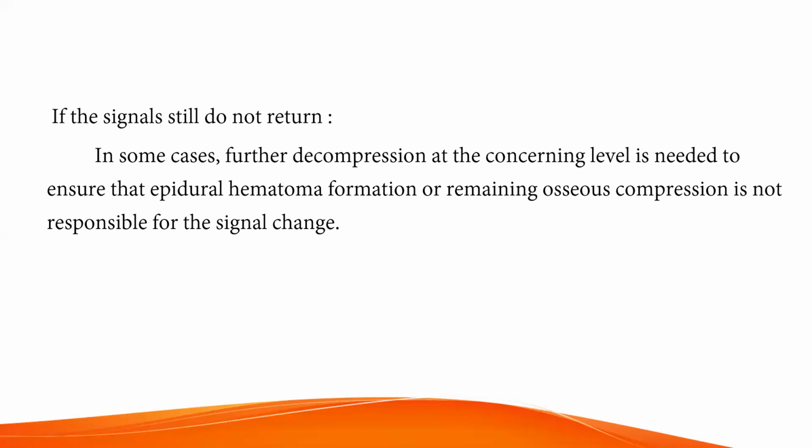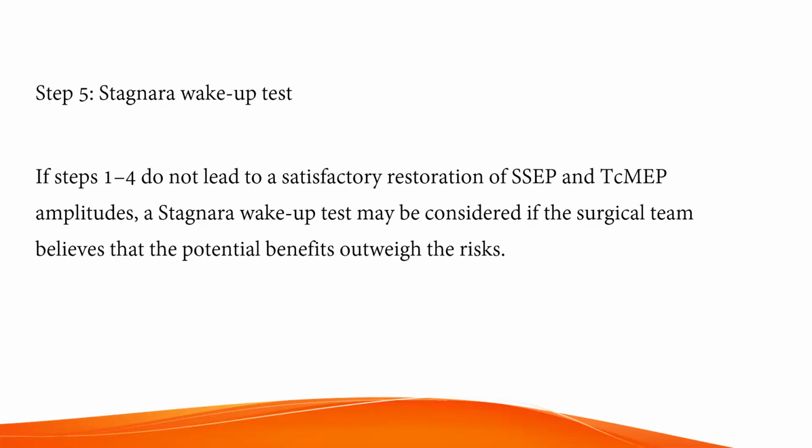So further decompression at the concerning level is needed to ensure that epidural hematoma formation or any remaining osseous compression is not responsible for the signal change. Even after doing all this, if the signal is not coming up, we have to consider Stagnara's wake-up test, that is, lighten the anesthesia, wake the patient up and ask to mobilize. Always we believe the potential benefit outweighs the risk.